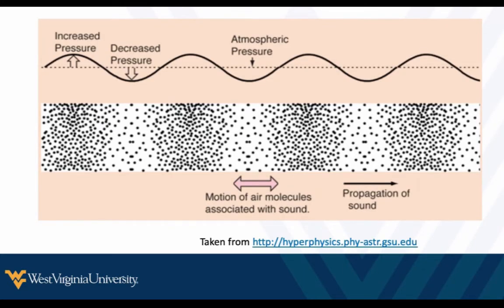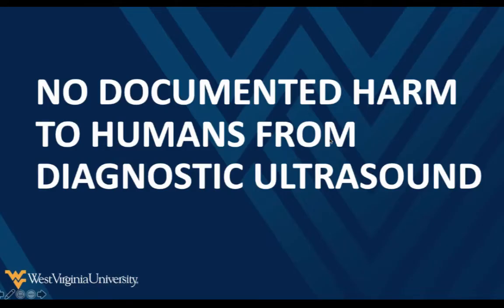So if you really want to get into physics, what happens with ultrasound is it's a longitudinal wave that goes through the tissue, and there are areas of compression and areas of decreased pressure or rarefaction where the molecules are compressed or spread out as the sound moves through the tissue. But as I said, no documented harms to humans from any diagnostic ultrasound at diagnostic levels.